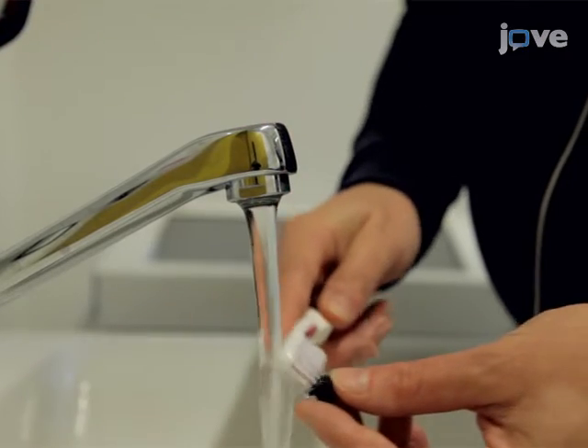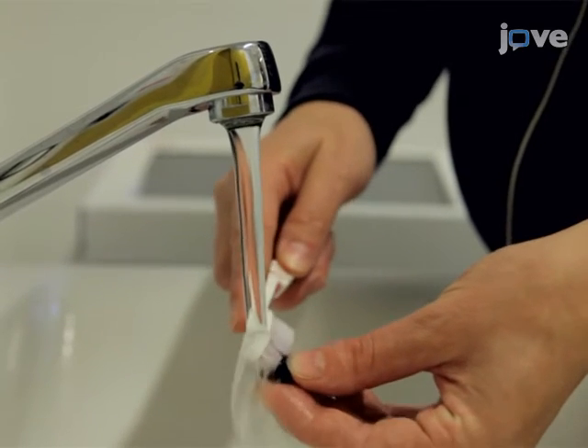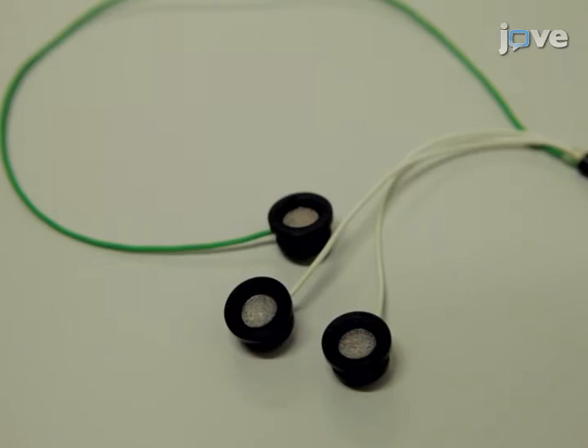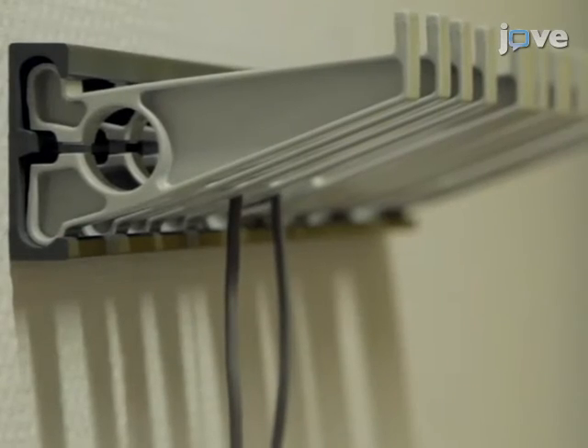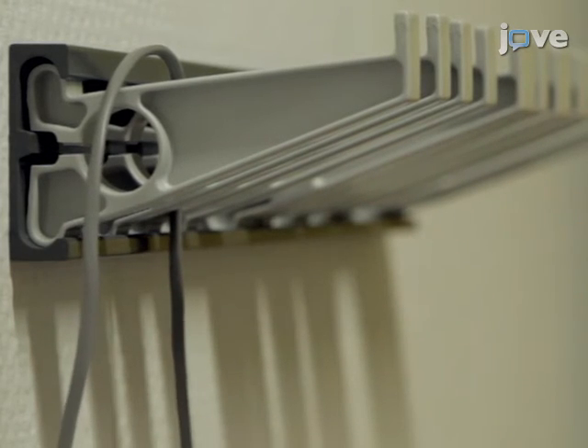After testing, detach the electrodes and clean them thoroughly with water. Remove the gel completely without scratching the silver chloride layer. After cleaning, do not wipe off the water but use a different set of electrodes on the next participant.